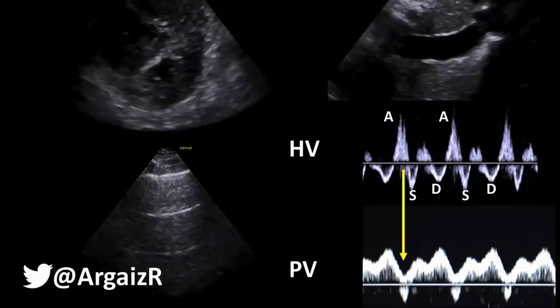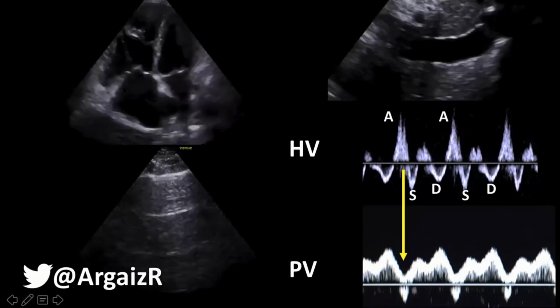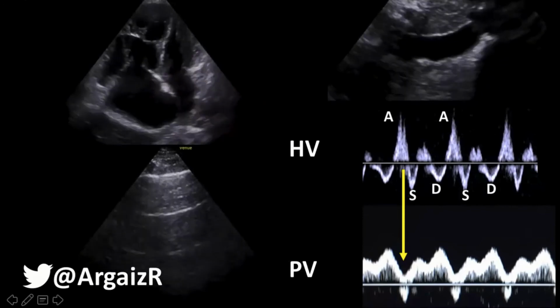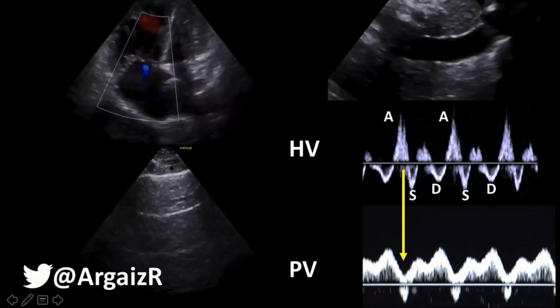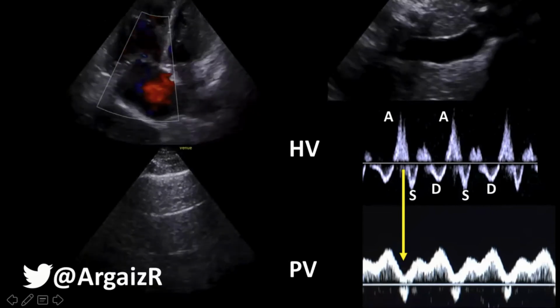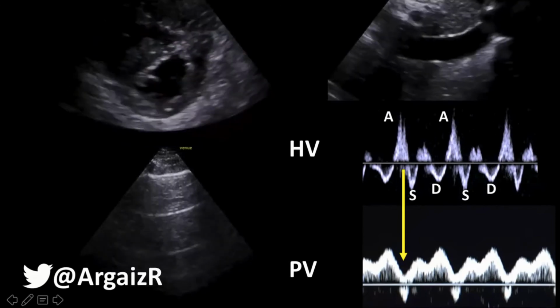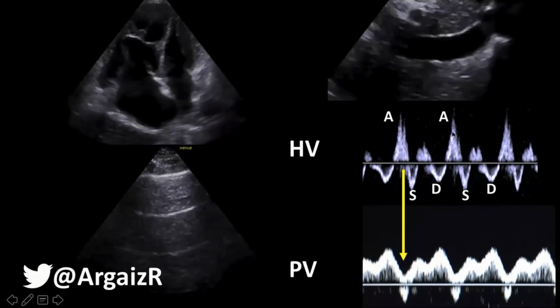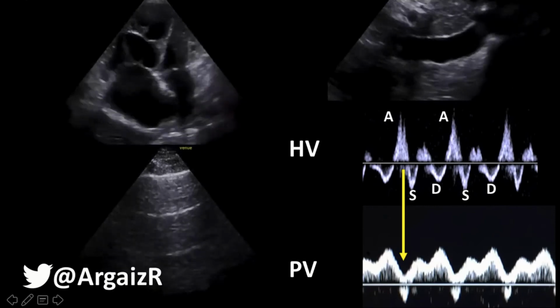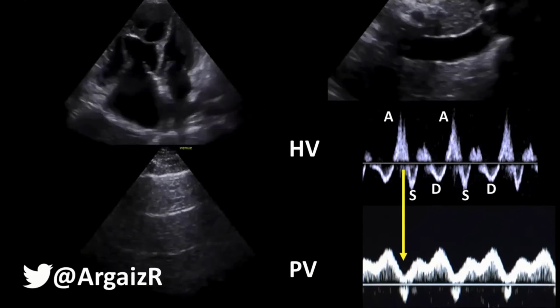And here's an example. This is a patient with severe chronic pulmonary hypertension and right ventricular dysfunction. You can see here the D sign and a dilated RV, but the left ventricular function is relatively preserved. And so this patient actually had a normal lung ultrasound with an A profile all across the board. And if we look at venous congestion, we see this patient had severe venous congestion as evidenced by a plethoric non-collapsing IVC, and an alteration in hepatic vein flow. This is characterized by giant A waves, very common in pulmonary hypertension. And this pressure is being transmitted all the way to the portal vein, causing increased pulsatility here, greater than even 60%. So this patient had severe venous congestion without pulmonary congestion.